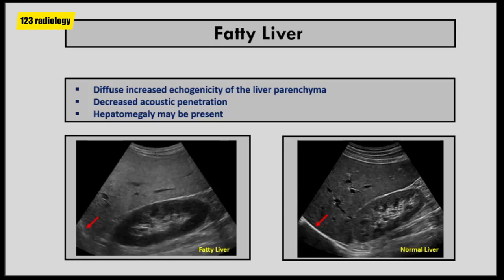Sonographic features of fatty infiltration depend on the amount of fatty deposition, and whether it is diffuse or focal. The key sonographic feature of diffuse fatty infiltration is diffuse increased echogenicity of the liver parenchyma and decreased acoustic penetration. Hepatomegaly may be present. On the image on your right, this is a normal liver — the liver is isoechoic to the renal cortex. On the image on your left, the liver shows diffuse fatty changes, manifested by diffuse increased parenchymal echogenicity compared to the renal cortex. There is decreased acoustic penetration with slightly impaired visualization of the diaphragm, as the red arrow is pointing.